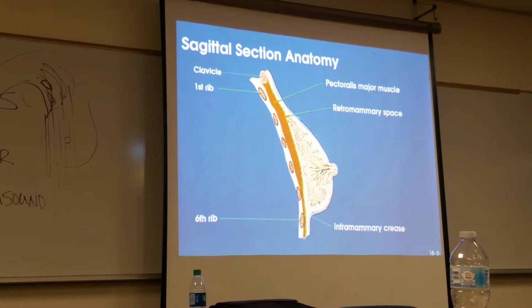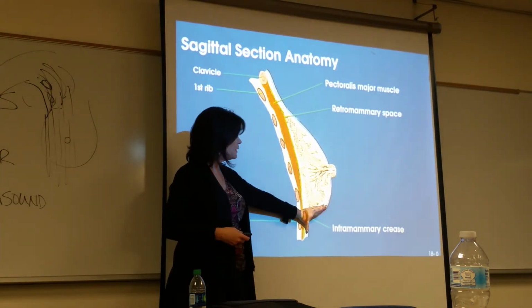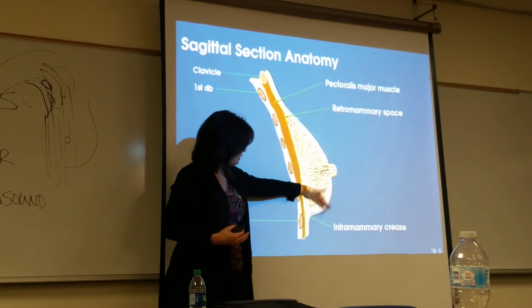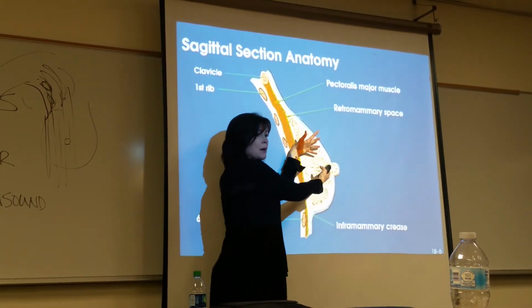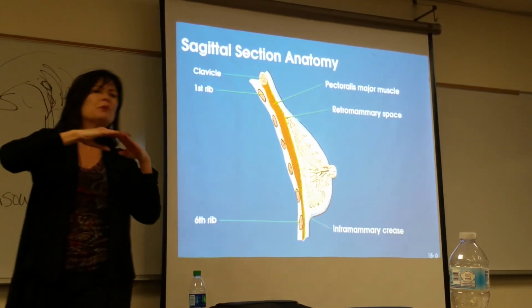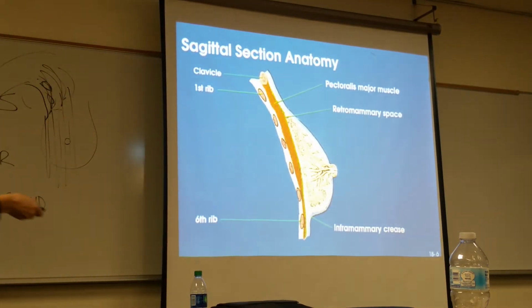So look, I'm not going to go over it too much, but a couple of things. Look at the breast anatomy. This inframammary crease is going to be important for imaging purposes. We want this fold right here to be open. Certainly with larger breasts, this is just a picture, but a breast would hang down, and that would be closed. So on a mammogram, the breast tissue needs to be brought up and out to open that crease. Again, anything that's folded or superimposed can hide a possible tumor. So it's important that that area is open.